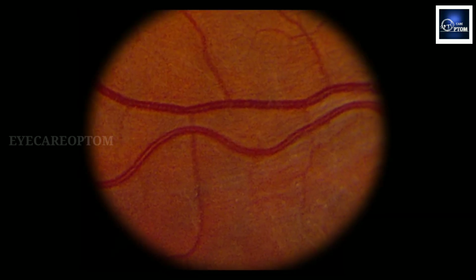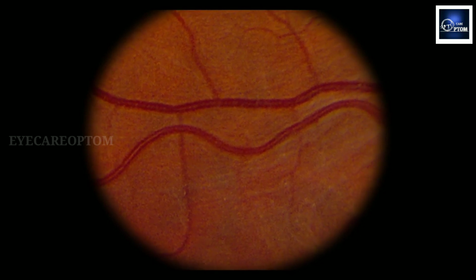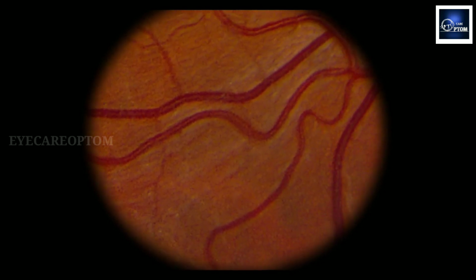You can start focusing around 20 cm from the patient's eye. Move closer until you reach the red reflex. After reaching it, adjust your power dial to get a clear view. Once you see the blood vessels clearly, follow them to reach the optic disc.